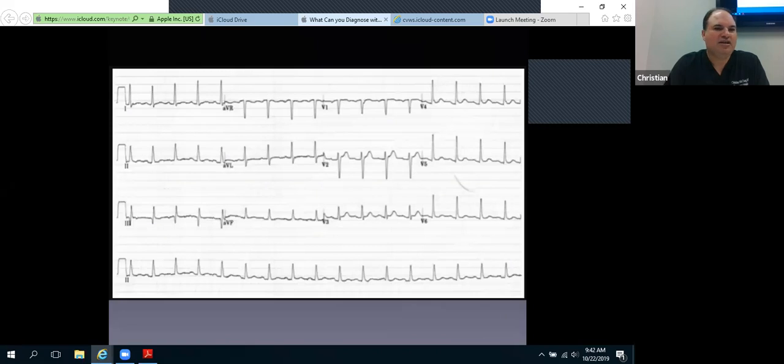The other thing worth mentioning is that reading EKGs is difficult because it's absolutely abstract. You're given 12 leads to look at, and those 12 leads are all in different rotational orientations. But the printout is one printout where you're just seeing all of the activity either up and down, right? And so I'll take you through what you're really being asked to do when you're reading an EKG.